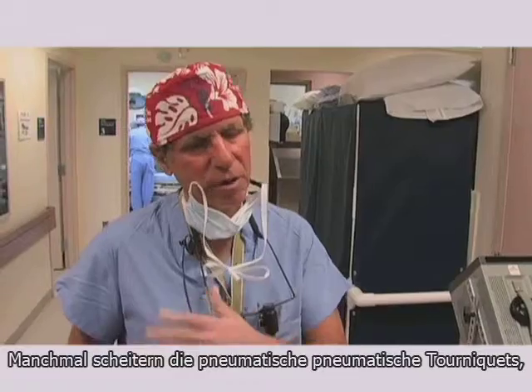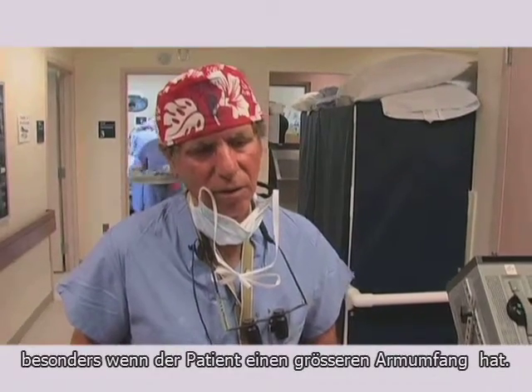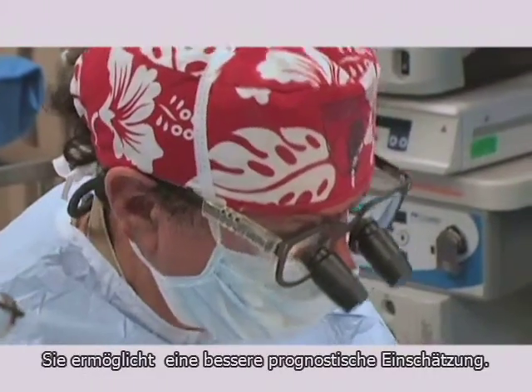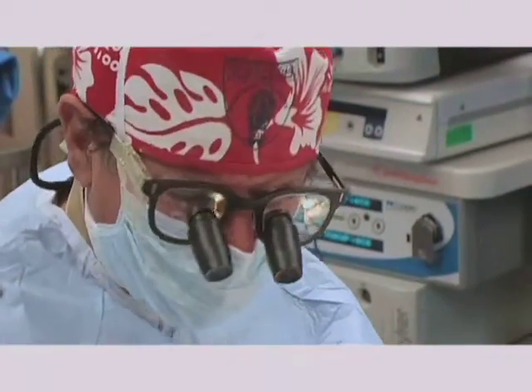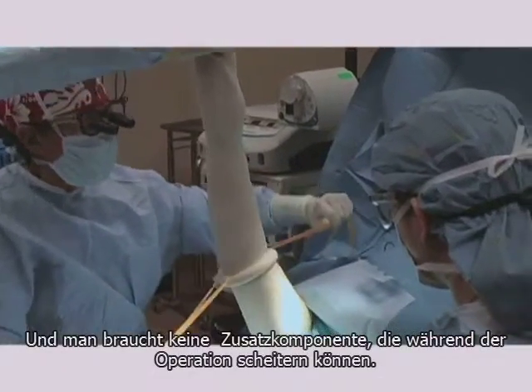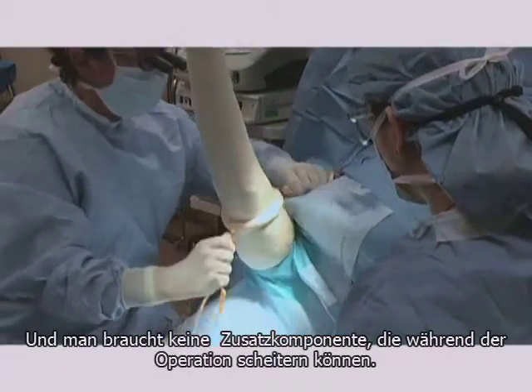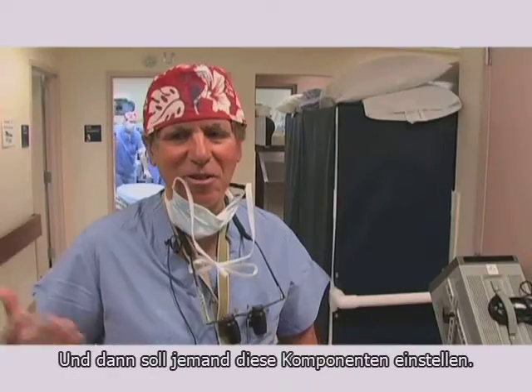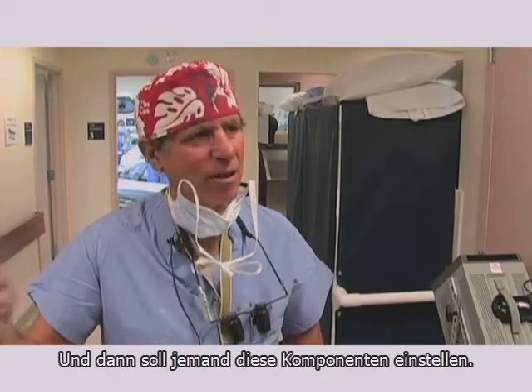It lasts a long time, where sometimes a pneumatic tourniquet, particularly with large arms, tends to leak. It gives me better predictability. I find it very easy to put on and it doesn't require attachment to a box that could fail and somebody has to regulate the box.